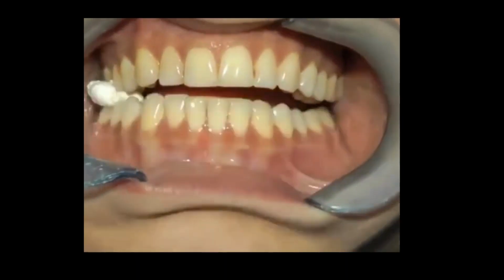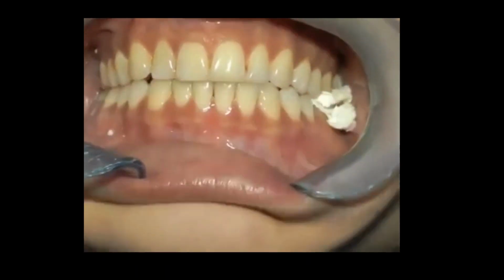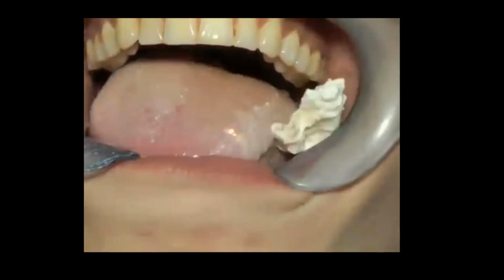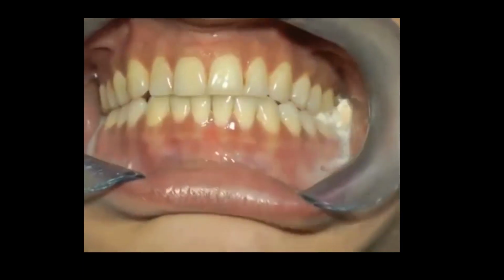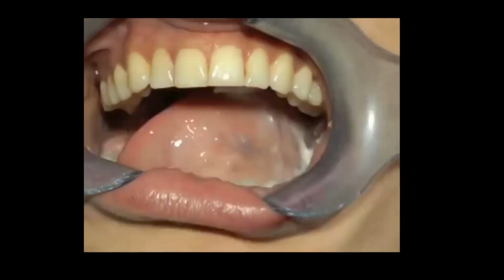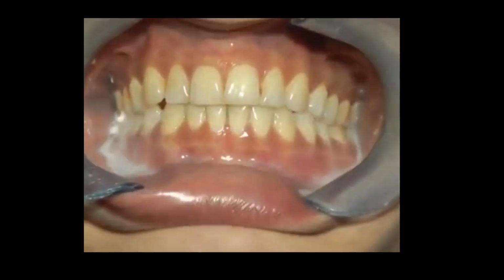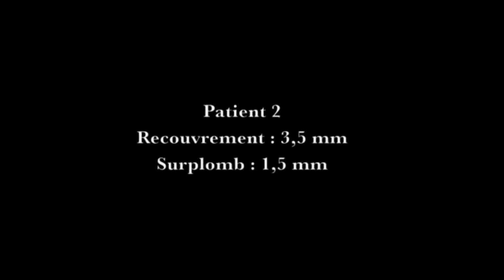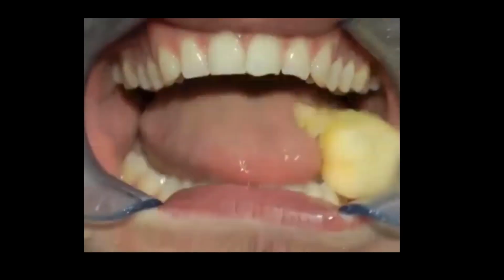Okay. Now this is chewing gum. Again, it's the same point where the teeth are flowing. There's a teardrop cycle. You actually can even see the freedom of Centric in it. There's that little bit of wiggle room so that they can land in that helicopter pad. That's going to create stability for a denture that sits on soft tissue. And it's also going to prevent the rocking of the denture, and it's going to prevent the chipping of denture teeth.